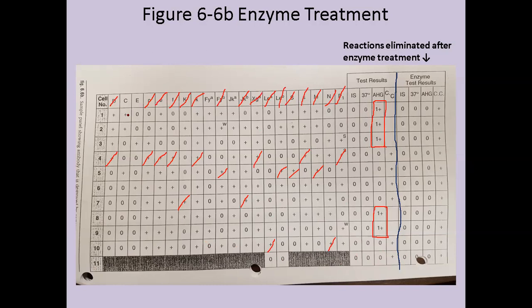So first we'll look at big C. Okay, positive here, positive there, positive here, positive there. Here's a mismatch. Okay, no big C, but patient's reacting. Okay, here the C antigen is present, patient's not reacting. And then there are additional reactions down here that C antigen isn't there. So we can say based on pattern matching, it doesn't look like big C.